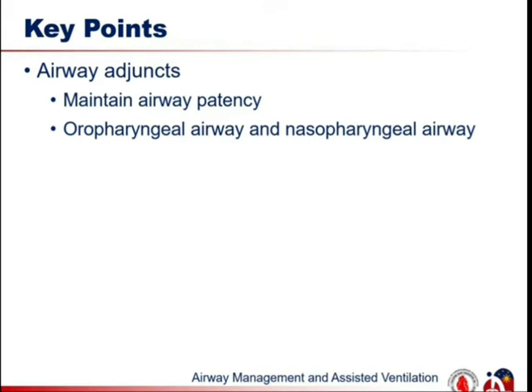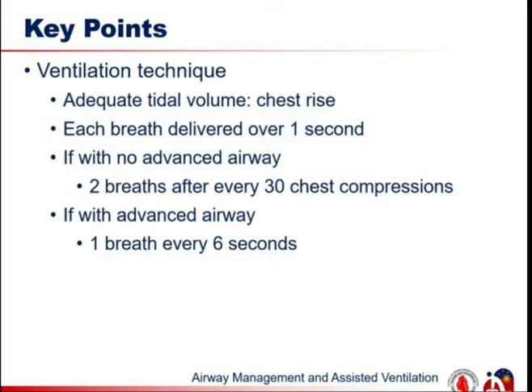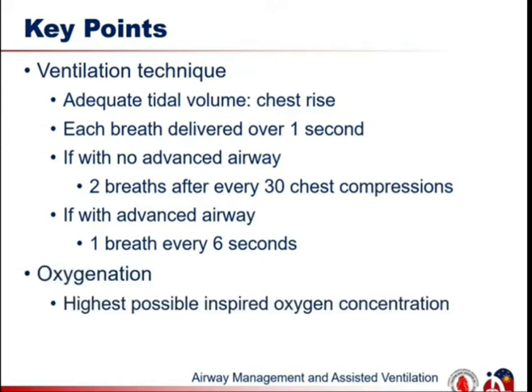In summary, we learned that airway adjuncts can help maintain airway patency during resuscitation, particularly the oropharyngeal and nasopharyngeal airways. We also learned about the different airway devices, both basic and advanced, as well as how to operate each. We learned the qualities of correct ventilation technique, as well as the administration of supplemental oxygenation during ACLS.